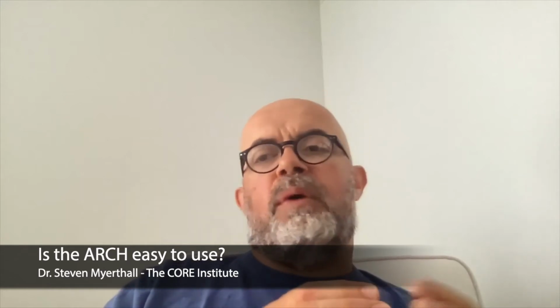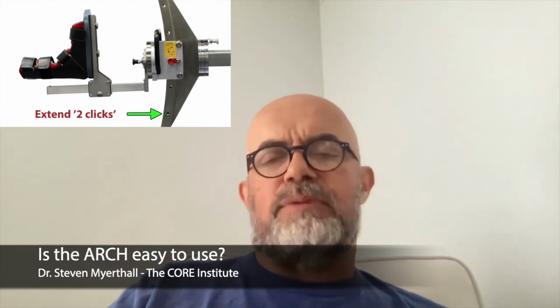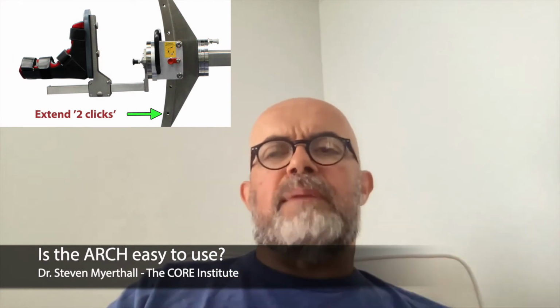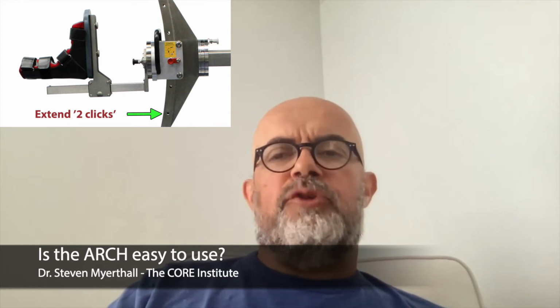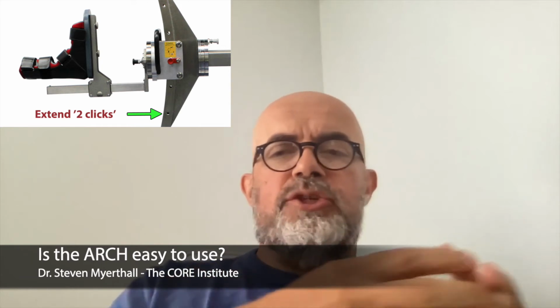I don't have to say lower it halfway to the floor, lower it a quarter of the way to the floor. I know that if I've done my releases properly, by lowering it only 2 clicks, which is a very short distance, I'm going to be able to adequately expose the femur and do my work on the femur. And if in lowering it 2 clicks, I can't expose the femur, then from my perspective, I need to do more releasing of the femur than having the individual operating the table lower it even further. So I think it's a very easy apparatus to use, and to have your circulating nurse or whoever it is in the room that's going to be operating the table use it.